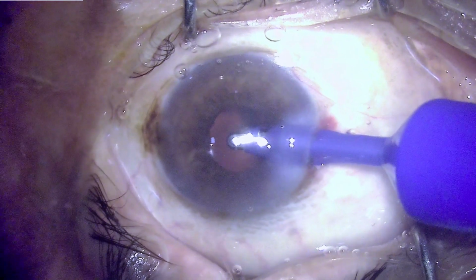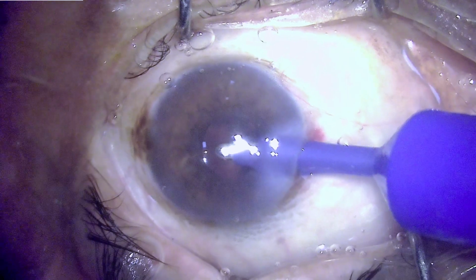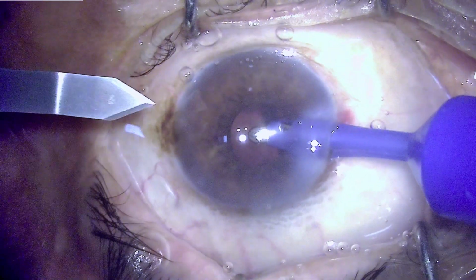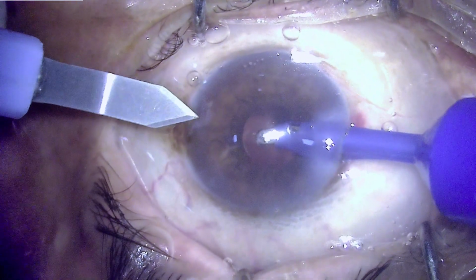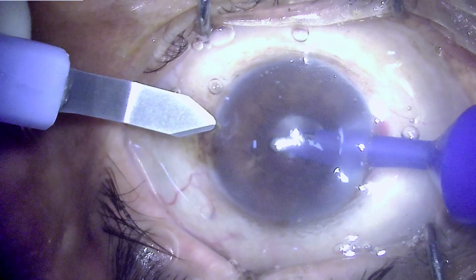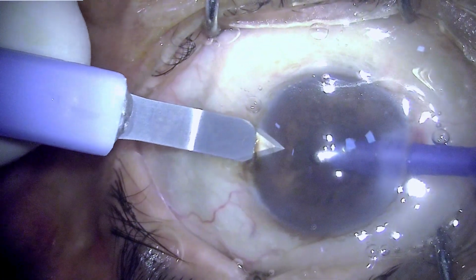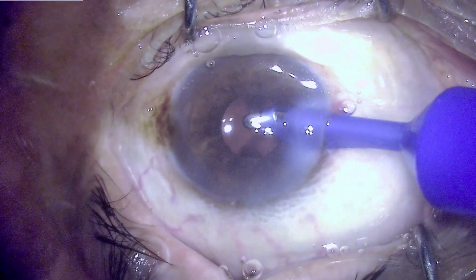The iris fluttering is appreciable. However, the surgery has been finished uneventfully, and this is the kind of consistency which I am talking about. Placing a clear corneal incision opposite to the 170-degree mark so as to neutralize or reduce the pre-existing astigmatism.